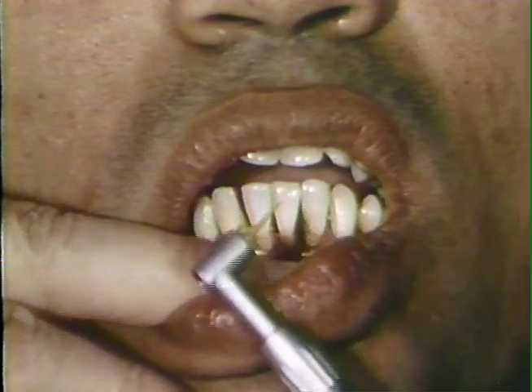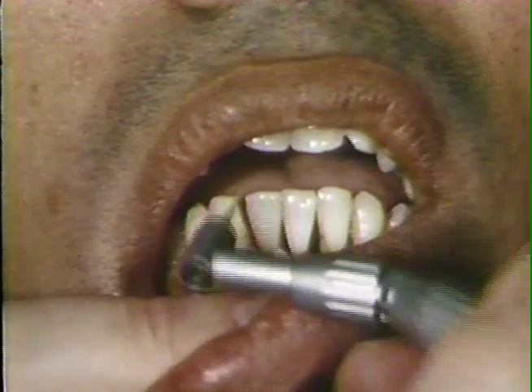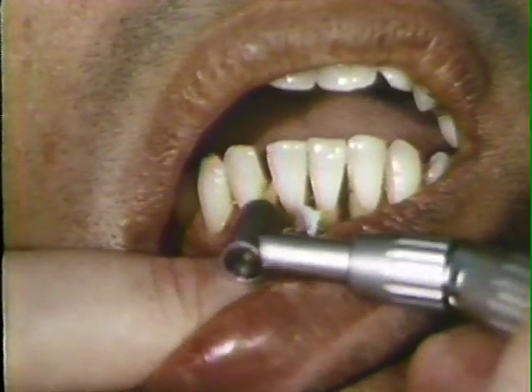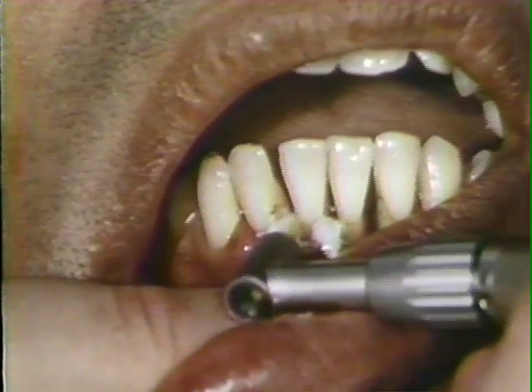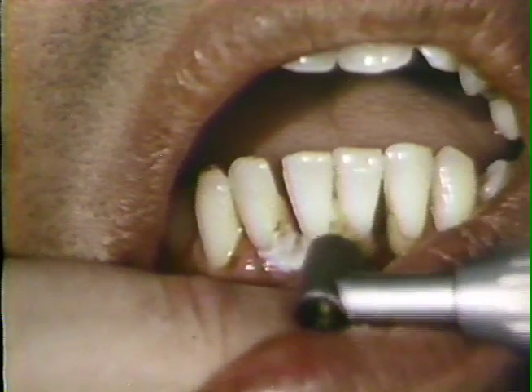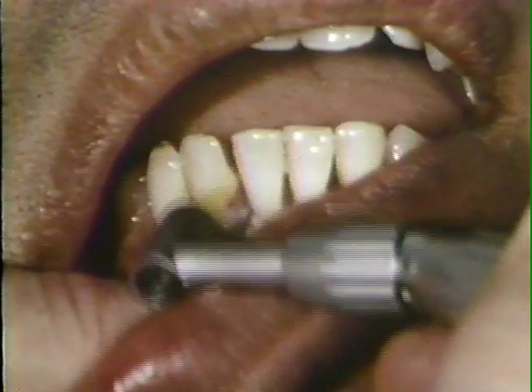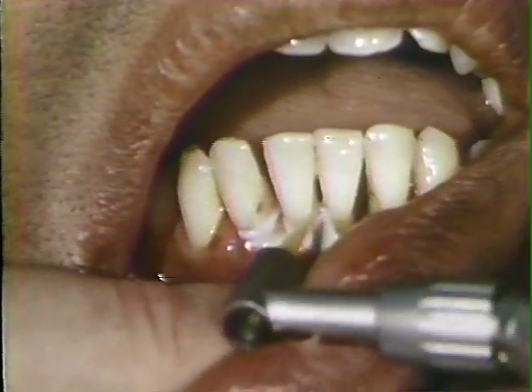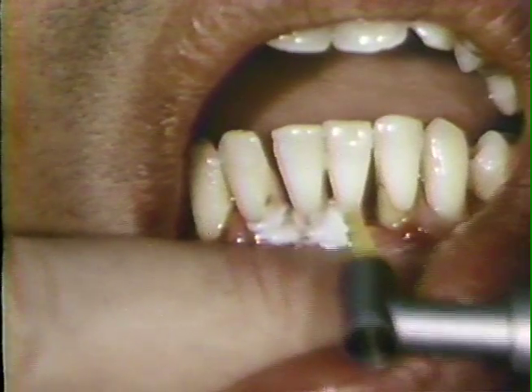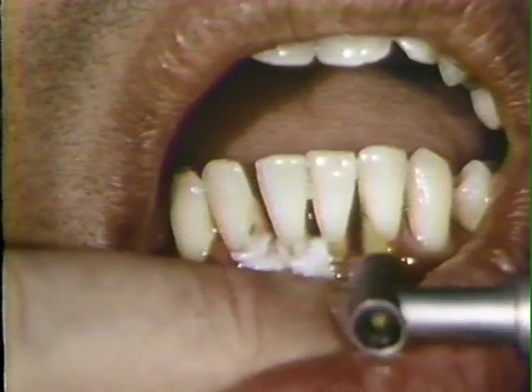Here, the instrument is used on the interproximal surfaces of the mandibular incisors. Again, the polishing paste is first applied to the teeth. The instrument can be used from the lingual or palatal aspect equally well. Polishing paste of various particle sizes can be used. However, a very fine paste should be used to provide the final finish.